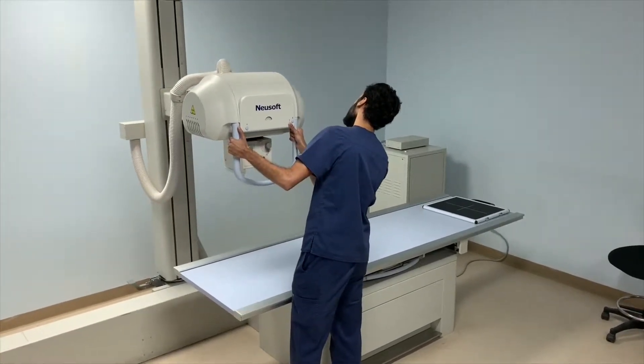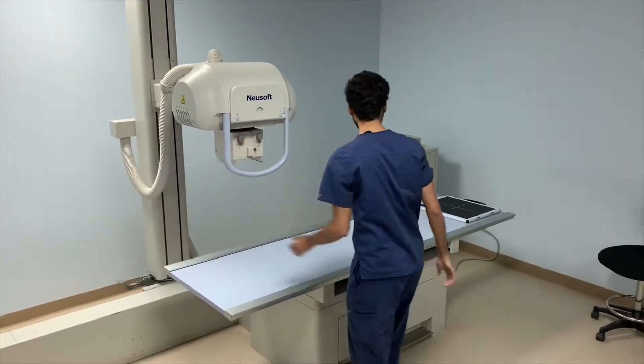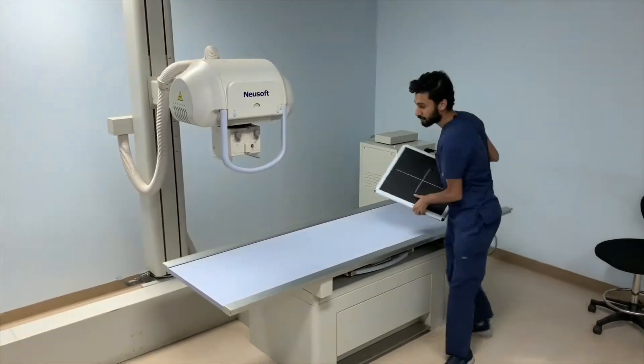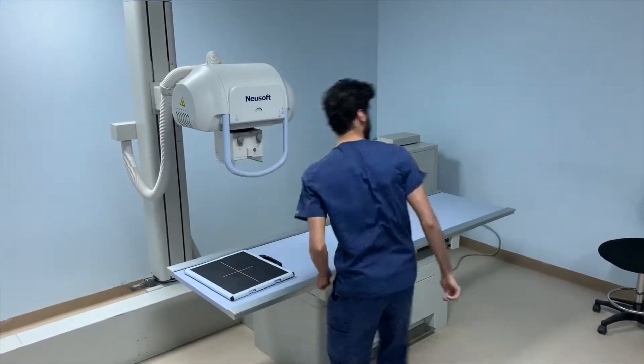Then he places the image receptor directly under the x-ray tube, cross-wise to the table, and grabs the chair right next to the table.